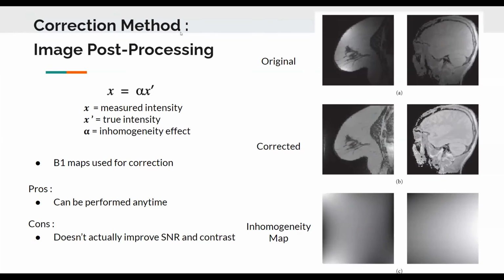Mickey, did you say parallel transmit was used at 3T? Yeah, parallel transmit is used at 3T, and even the scanner, like the G scanner that we have right now, has 2 channels. It has the quadrature coil. It's a birdcage quadrature coil where you can actually phase differently in magnitude and phase the 2 elements there, in order to create a more homogeneous transmit field.